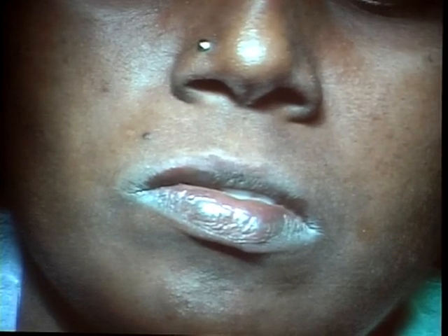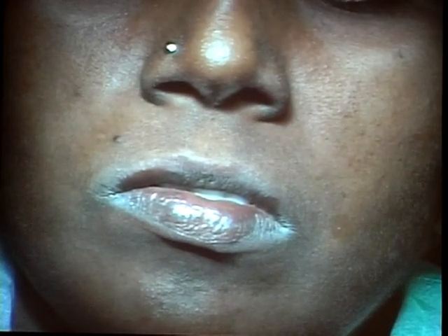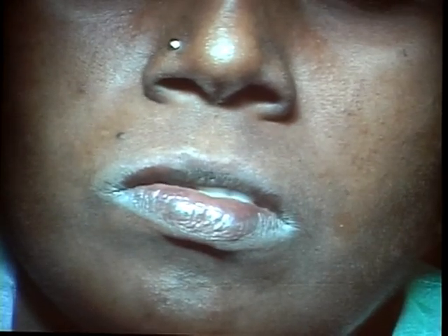We'll try to do that with only topical anesthesia. What setting have you got? It's 1 watt continuous wave and 810 nanometers. This is White Star from Creation.